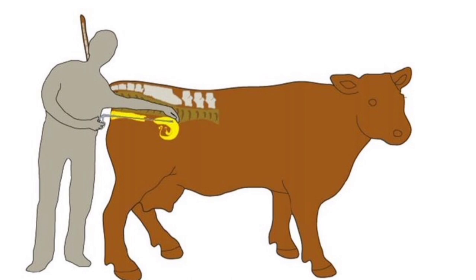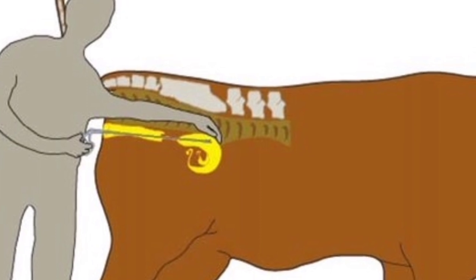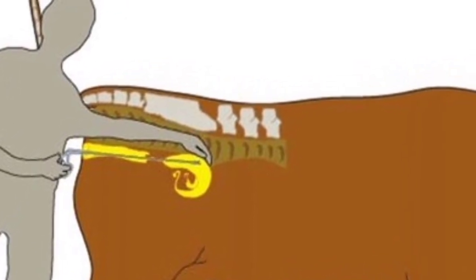Here you can visualize the process diagrammatically. We can see the person is doing a per rectal examination and then inserting the uterine punch to grab a biopsy sample from wherever required.